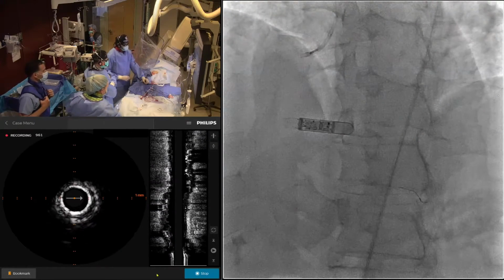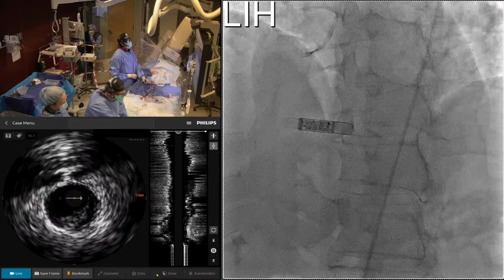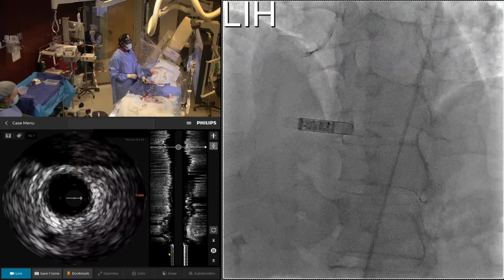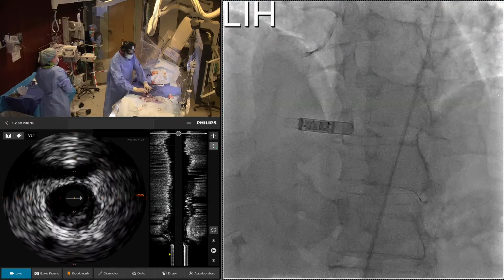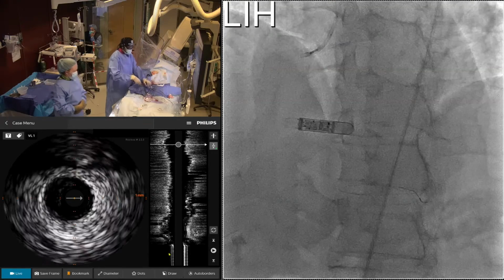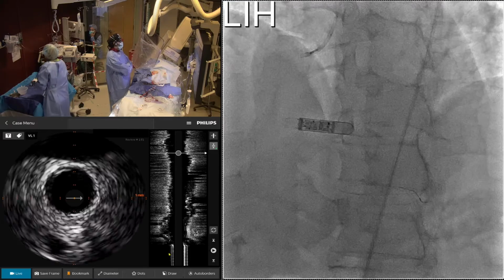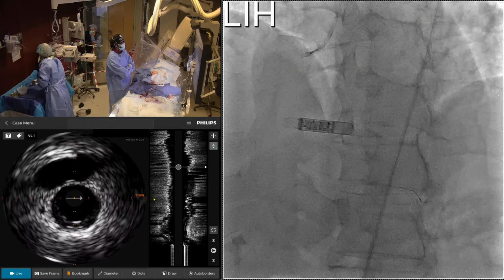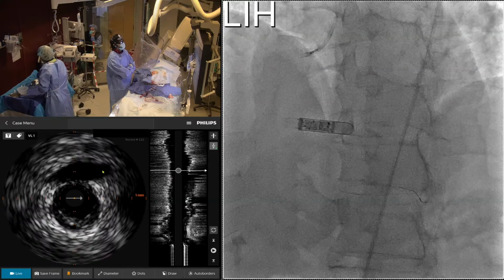Okay, great. Let's do a couple of measurements here. Let's just look distally. So distal, there is a lesion here, but then I need to do an angio, guys. No, you can use the old one. Don't do anything, I didn't move the table. Look, this is all pretty much normal, frankly, here. And then the disease is by that branch.